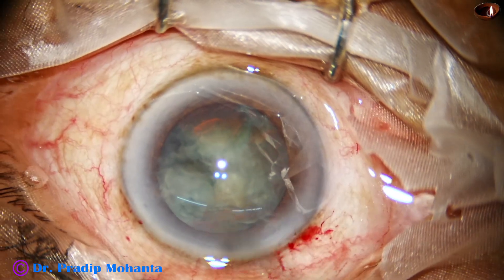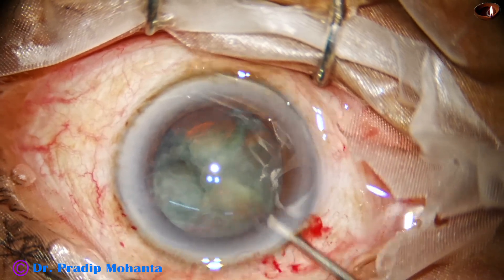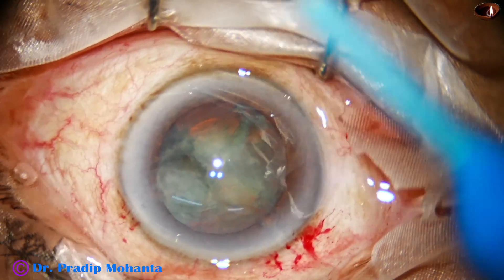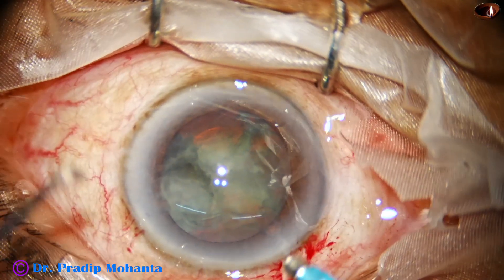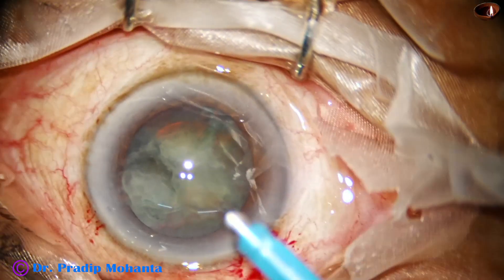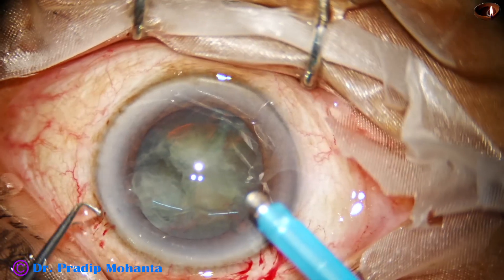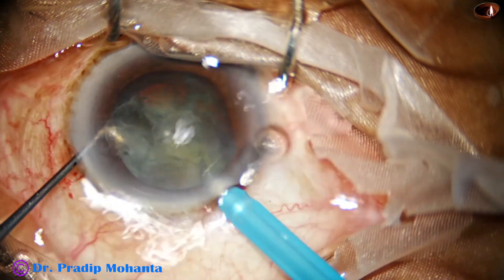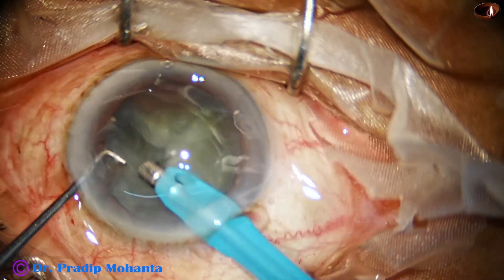The only thing is I could keep the anterior chamber depth okay, but in your hands what is going to happen is you are going to lose chamber. That is because you are going to press the posterior wall of the main wound, the posterior wall of the side port, and visco is going to come out.